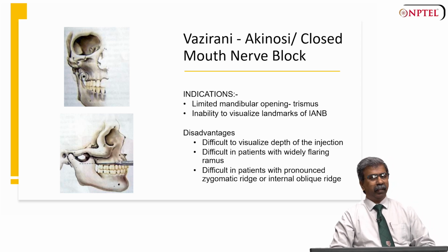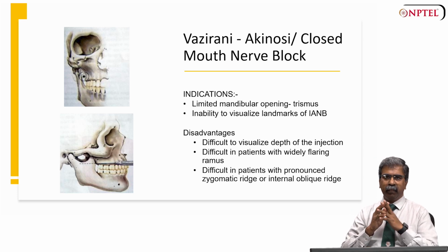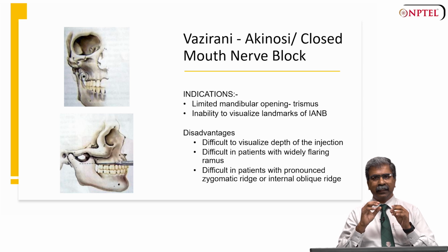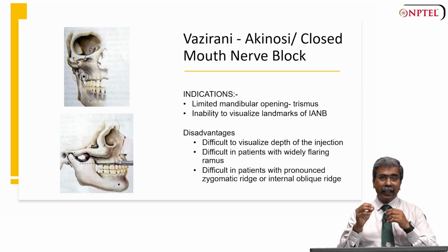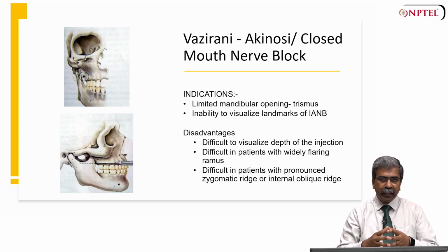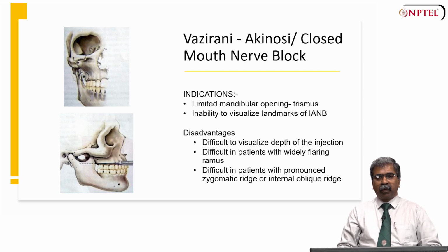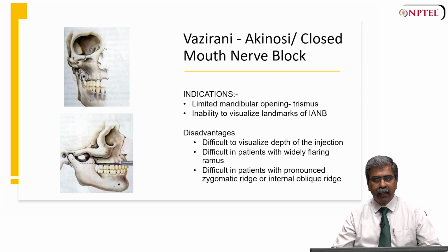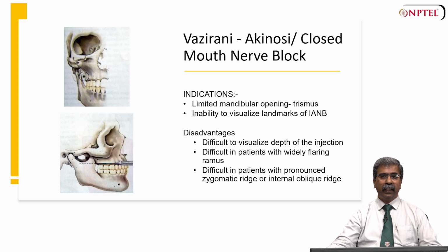Difficult to visualize the depth of injection. It is again a blind procedure, and there are challenges in patients with wide flaring ramus, because this technique may be less effective in such patients, complicating the needle placement. And in patients with a prominent zygomatic ridge or pronounced internal oblique ridge, this can hinder the effectiveness and accuracy of this technique.